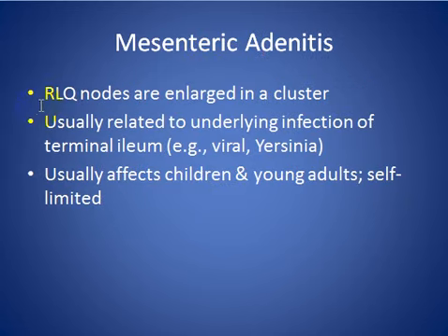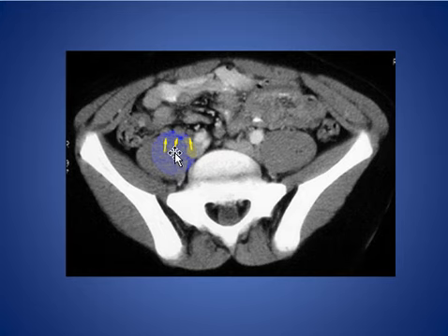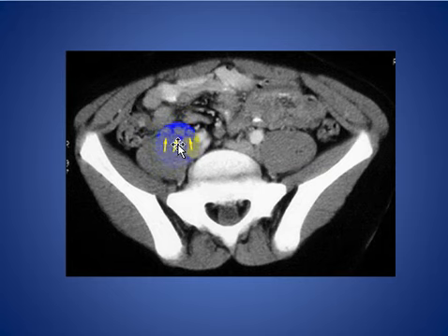Mesenteric adenitis: right lower quadrant nodes are enlarged in a cluster, usually related to underlying infection in the terminal ileum, either viral or Yersinia. It usually affects children and younger adults and is self-limited. Here you see a patient with mildly enlarged lymphadenopathy anterior to the right psoas muscle in the right lower quadrant.